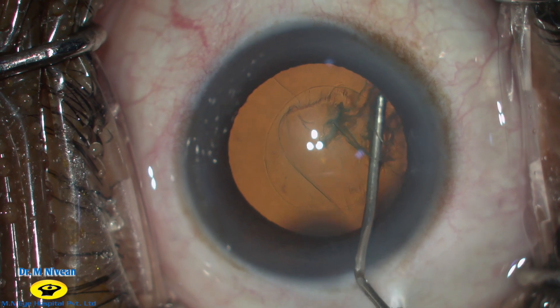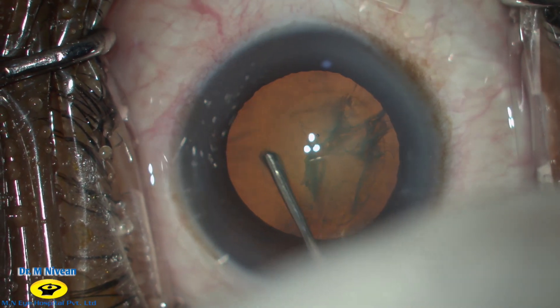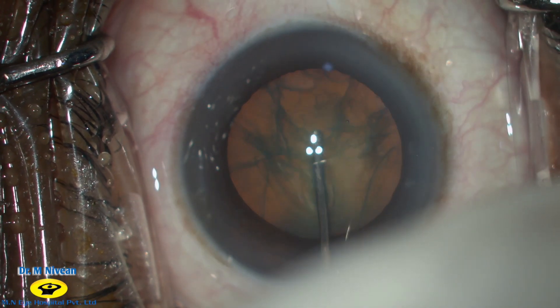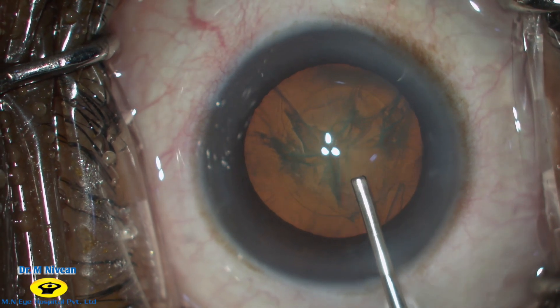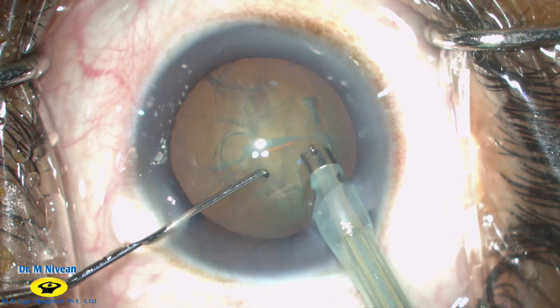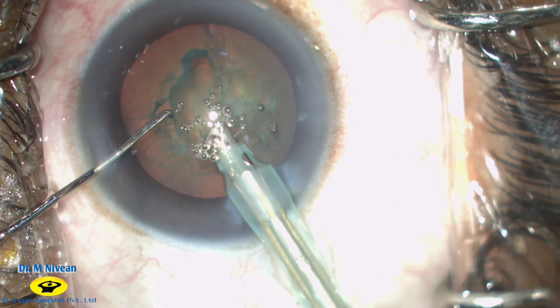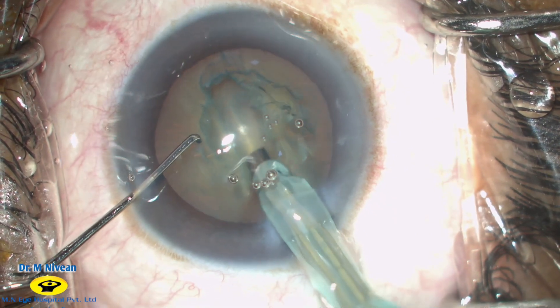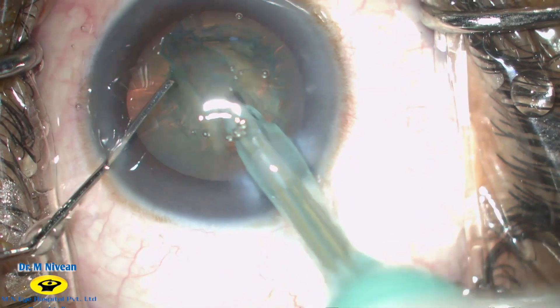Hydrodissection is then done from one pole and you can see the fluid wave going towards the other pole as well. The nucleus is then tapped in the centre to decompress the capsular bag. Phacoemulsification is then started and the loose cortical matter on the anterior surface of the nucleus is shaved off. Trenching can then be initiated, with trench thickness set to one and a half times the thickness of the phaco probe.